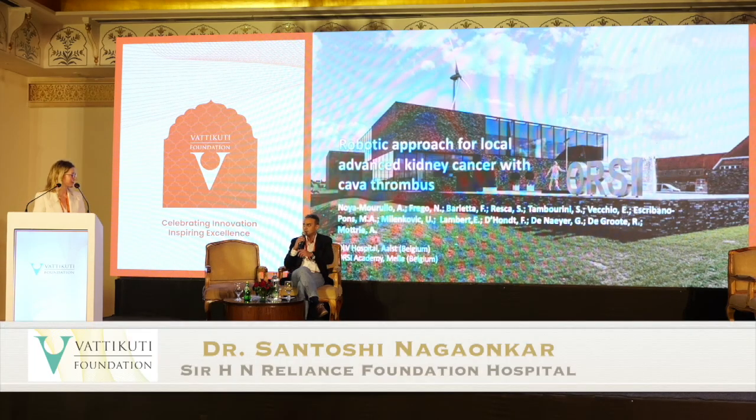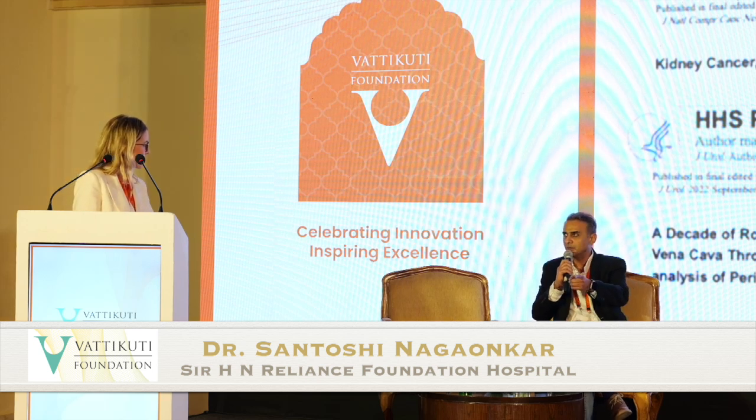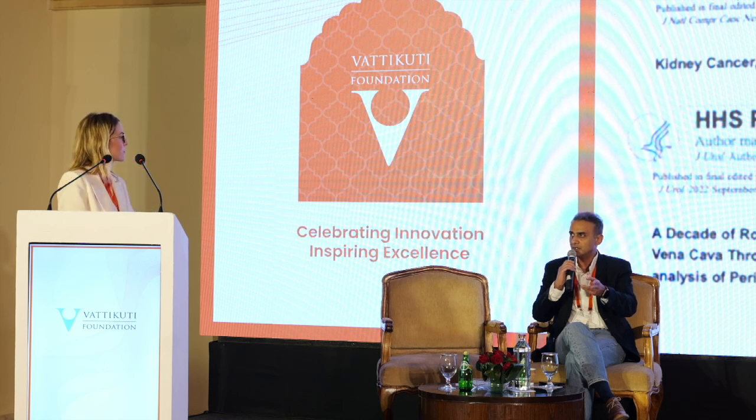Very nice demonstration. Just a couple of questions. One thing I noticed, probably because you edited it, was that you didn't instill heparinized saline before you released the clamp of the IVC. Do you think it was important to do that, or have you not shown it here because of the possibility of air, as it's a big cavotomy? Normally you just flush the IVC with heparinized saline before you release the clamp.